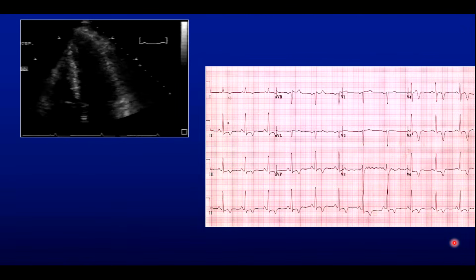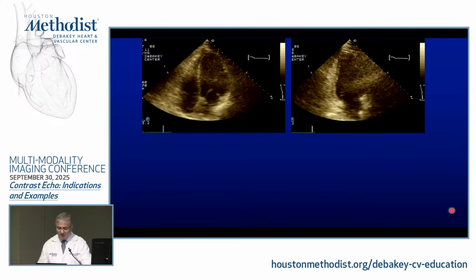I infer that the wall motion is decent because the epicardium is coming in. I cannot tell you about the endocardium per se. And this is what you get with contrast. It's an apical HCM with typical deep symmetrical T waves, but there still could be ischemia, right? We don't have previous EKGs to know what the situation is.